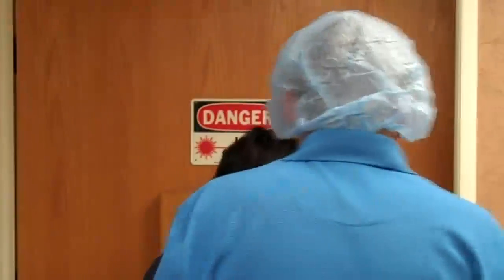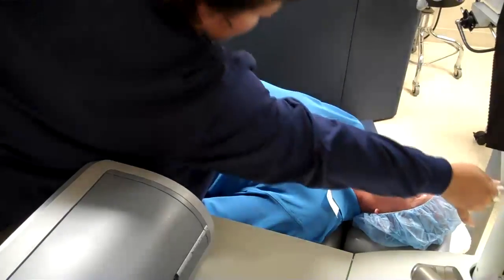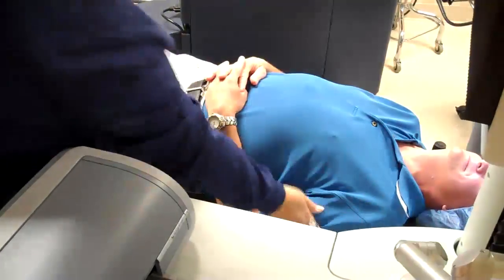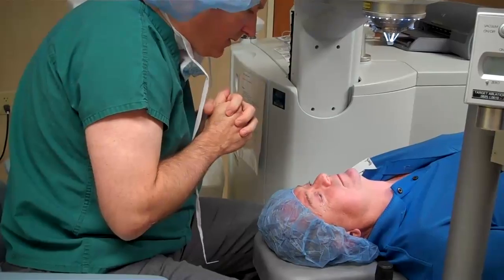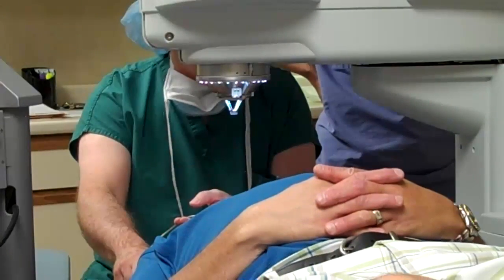When that's completed, the patient is brought into our refractive surgery suite and they are first positioned on the bed and positioned under the intralase. The intralase is the laser that's used to create the LASIK flaps. Once the patient is positioned under the intralase, I let them know what to expect. The flap is created first in the right eye, followed by the left.